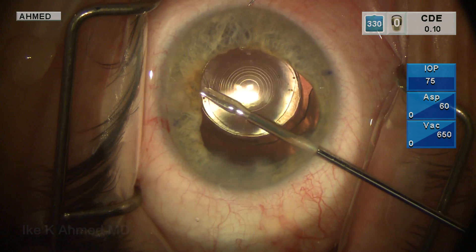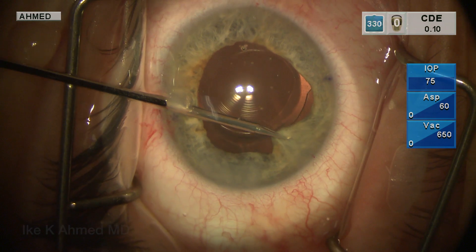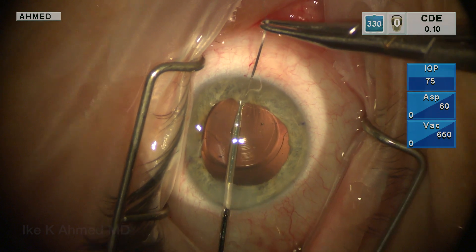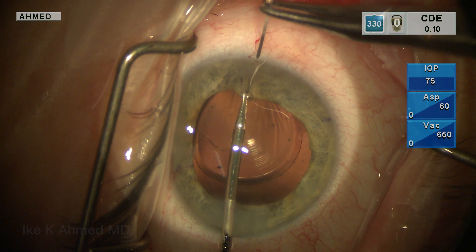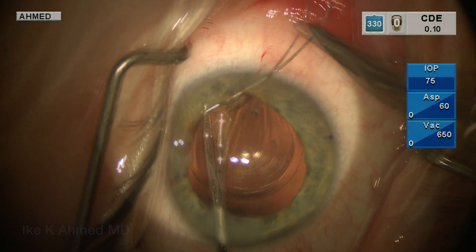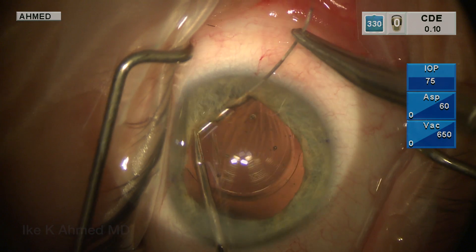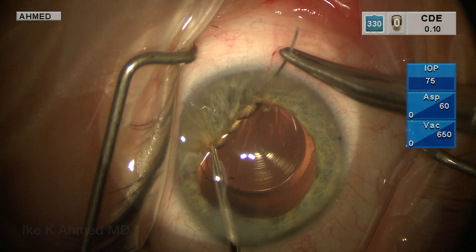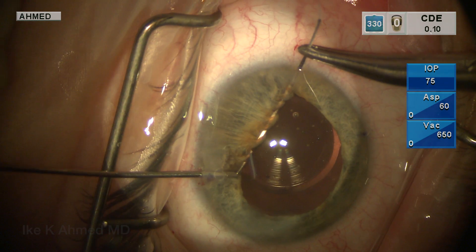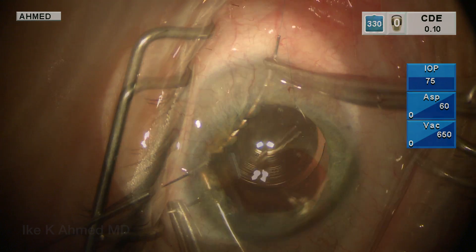We will then examine the iris, as you can see here. The iris is still intact, fairly spongy, and of course can be stretched into position. We'll start at a nasal paracentesis with a 10-0 prolene suture on a long CIF-4 needle. This is the pupillary cerclage technique that we're going to use. The use of a micro-grasper in our left hand helps us to mobilize the iris into position to the needle. So the needle actually doesn't do a lot of the work — it's the forceps hand bringing the iris to the needle that helps pass the needle through the peripheral iris.